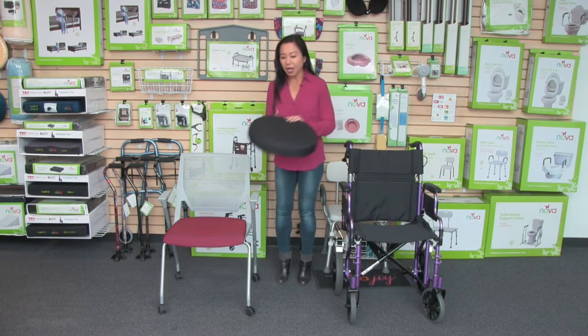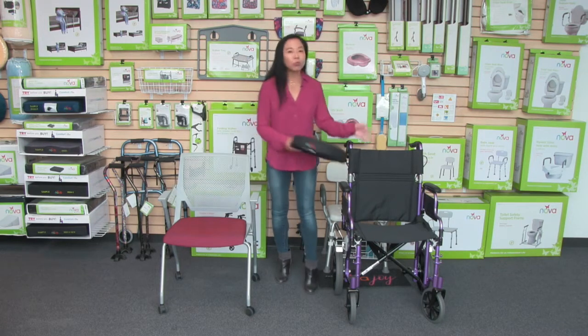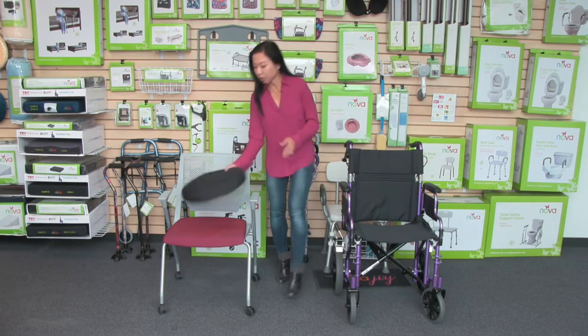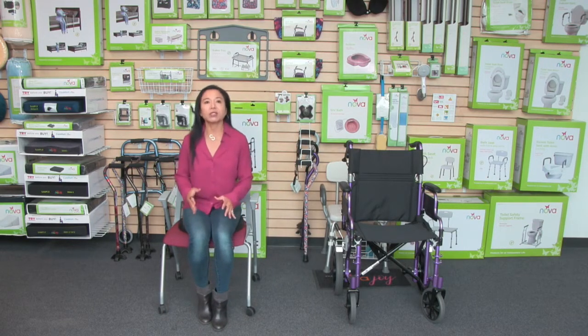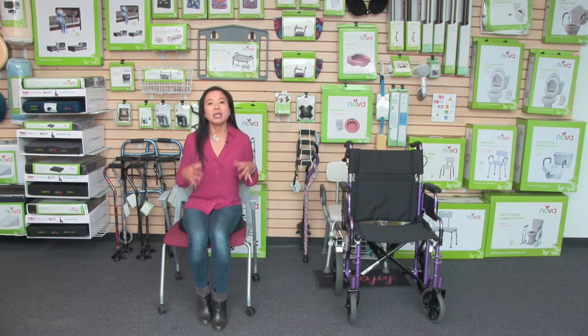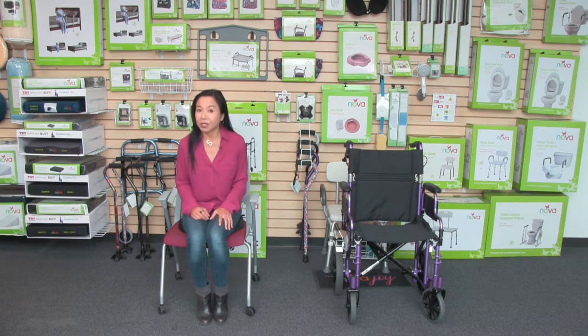This cover is removable and washable and it's great for wheelchairs, chairs, benches, and even a car. It's a great everyday cushion and when I'm sitting on it I can feel that egg crate — it gives that circulation, and that circular cut-out in the middle relieves pressure from those sensitive areas.